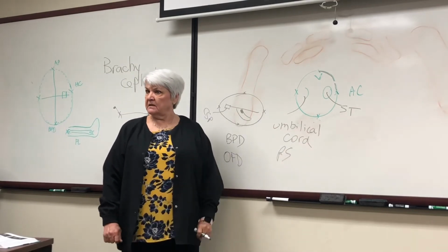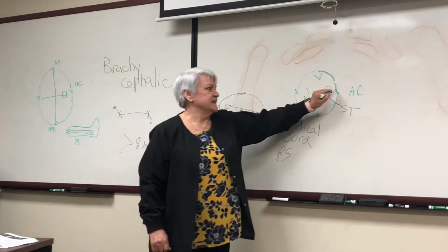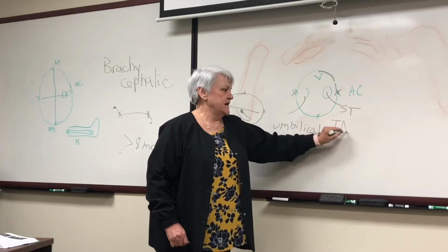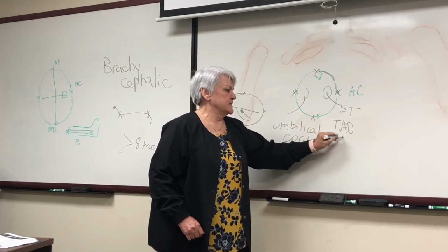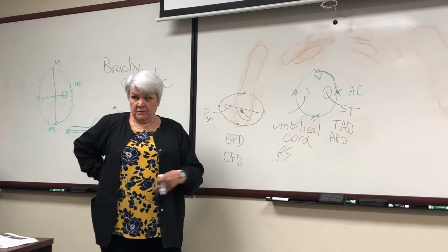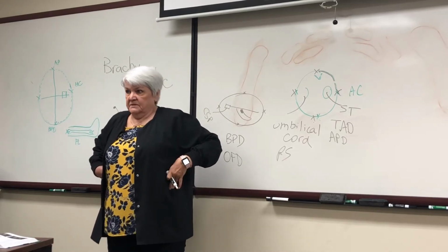TAD, which one's that? Yeah, TAD. This is your TAD, TAD, and this is your APD. Anterior posterior diameter, transverse abdominal diameter.